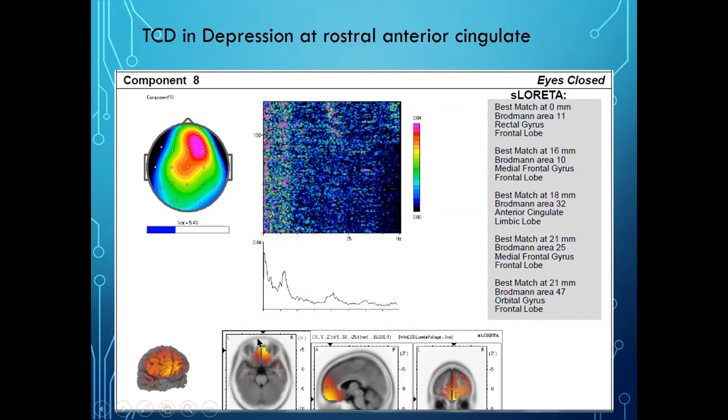So look before you leap. Don't dive in before you actually look what's under the surface. You can see the pattern to target. This is a dysrhythmia, and it gives you a really quite direct target for TMS. Now, the fact that it has a theta peak also suggests that this might respond to ketamine or one of the dissociatives. MDMA, DMT, psilocybin, etc.